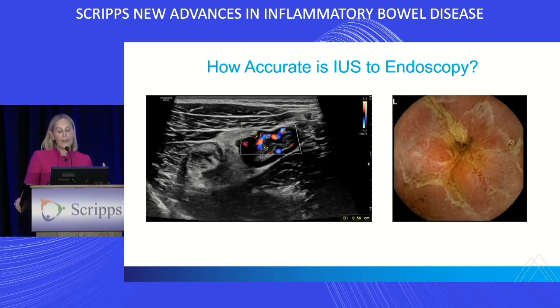Maya, this is Millie, this is your goal. You're going to do it in 3 minutes. It's like name that tune. I walk into Mike, I'm like, how quickly could you tell me what I need to do next? When you do 4,000 of them, which is how many Mike has already done, you're doing it in 3 to 5 minutes. It's really quick. You go to your sigmoid, you go to the ileum, you know where you need to go, you look, and you make a decision.